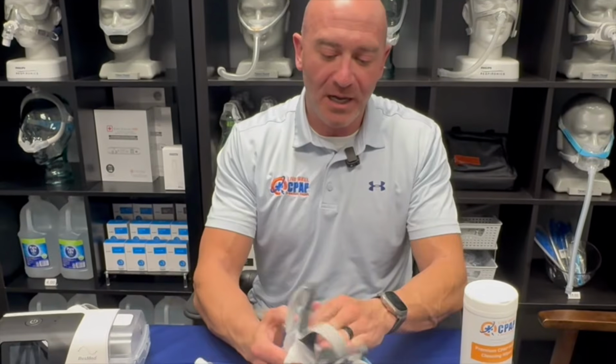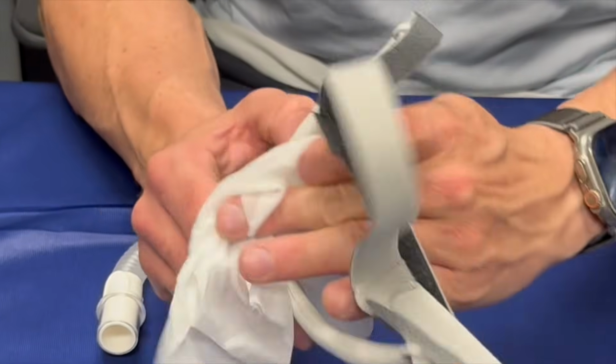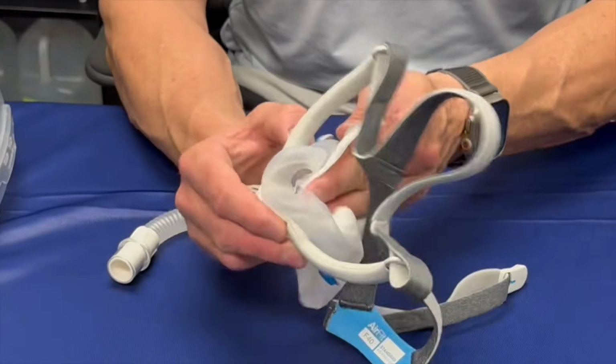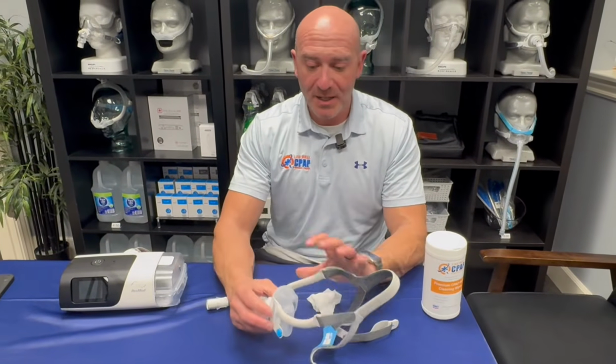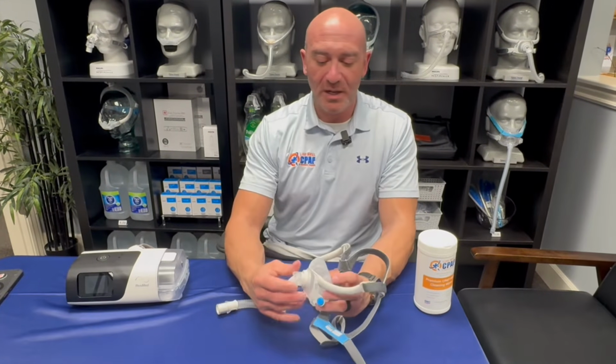Baby wipes are a great way. Baby wipes are a less expensive CPAP wipe. But make sure you're getting the baby wipes with not a lot of additives in it, no softeners, no perfumes. And then a quick wipe down, inside and out of the mask. This gets most of the oil off of the mask, and that's what you want to get. So typically what I'll tell my patients is, if they don't want to take the whole thing apart every day, wipe that down, and then once a week, give the whole thing a bath in warm soapy water.